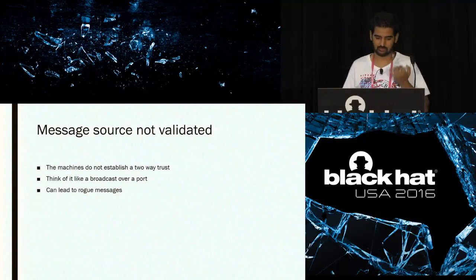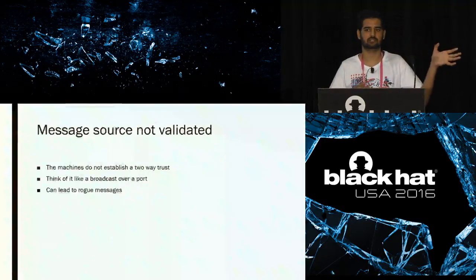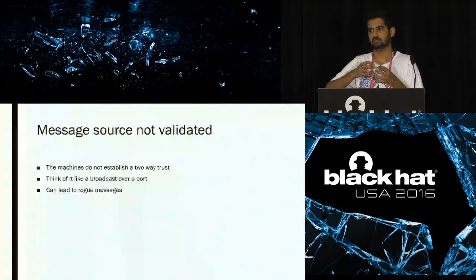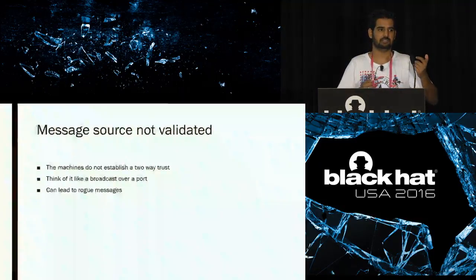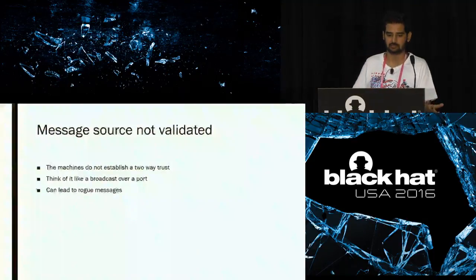Message source is not validated. Now, this is a problem when you have a bigger infrastructure. So let's say you have a patient monitor which is sending messages to your EMR system. EMR is electronic medical record. Now, what happens is these two know that the EMR is listening over a port, but it doesn't really care where the message is coming from. As long as it is in a particular format, it will start processing it. Right? Just think of it like a broadcast.